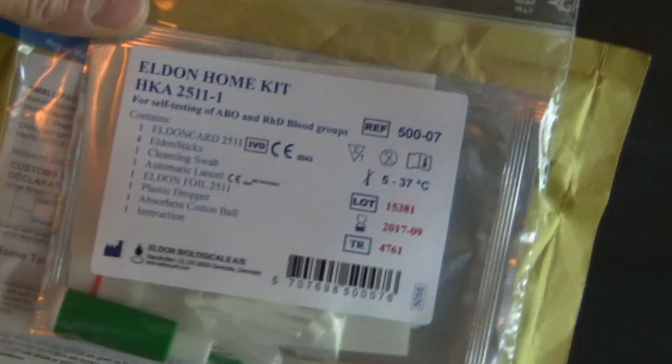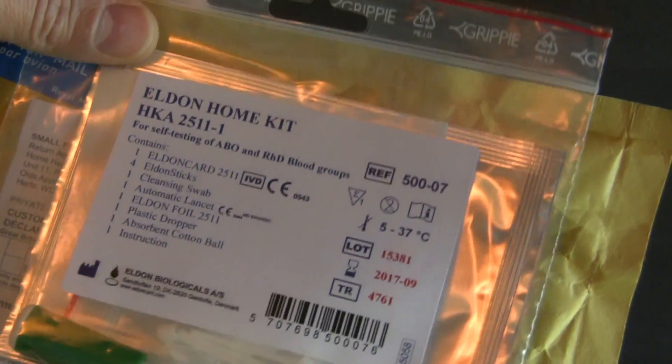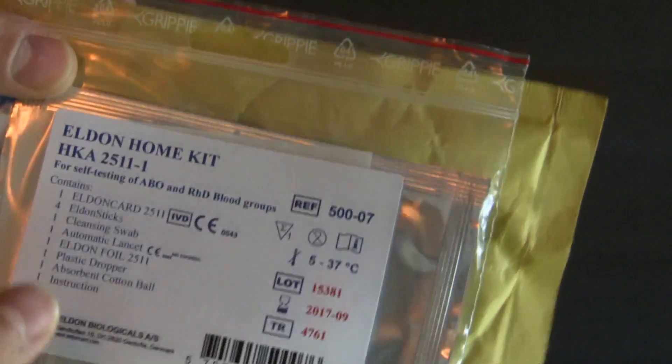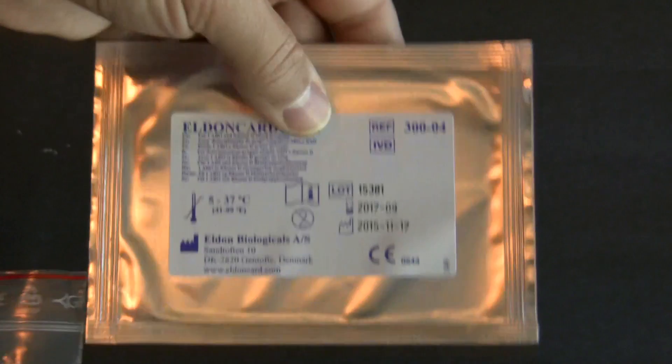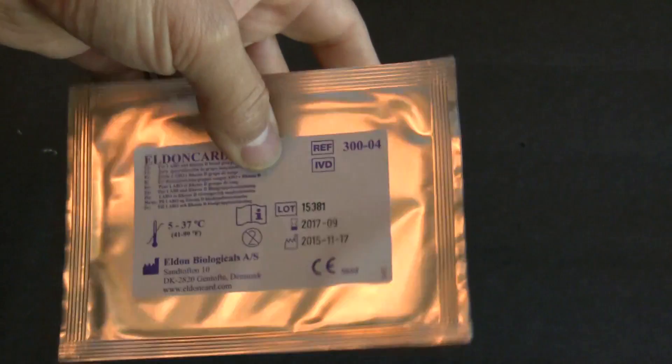I just got the Eldon home kit blood test kit to test what my blood type is. The test kit comes with the Eldon card, that's where you drop your blood.